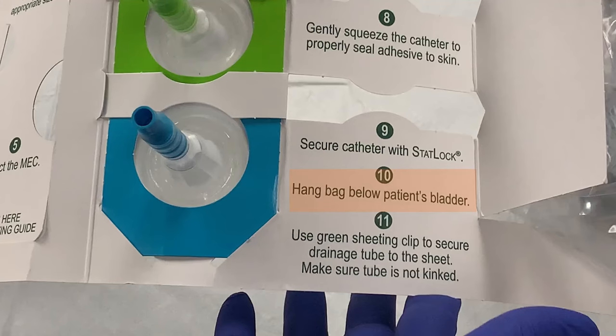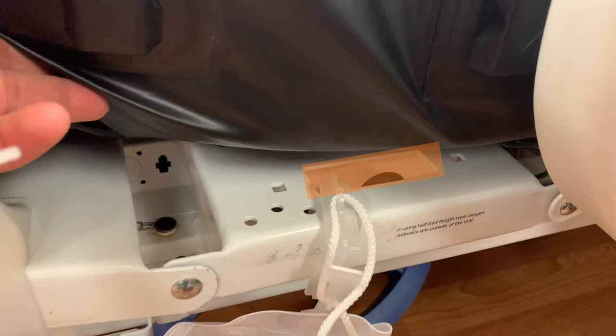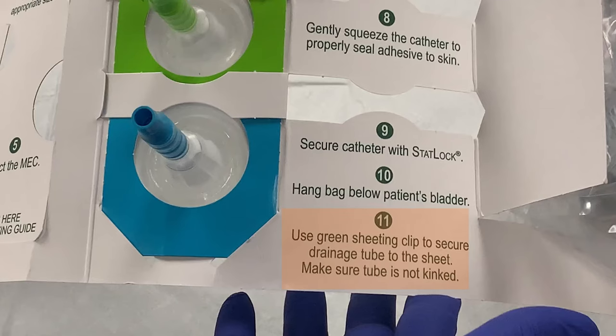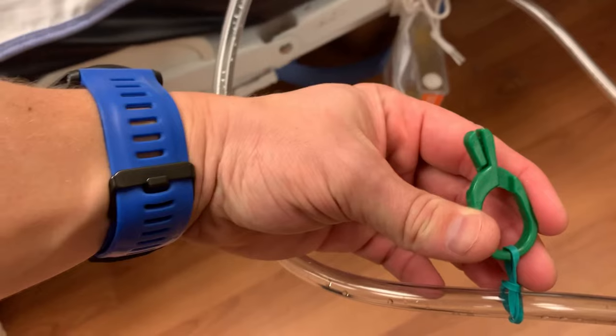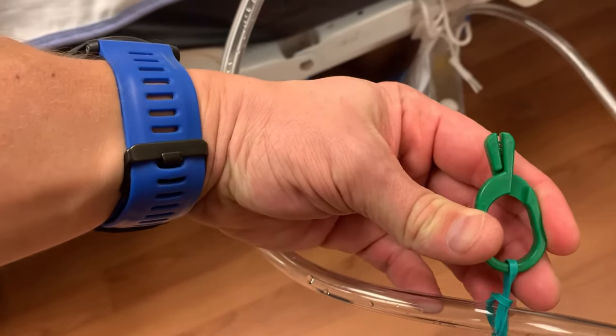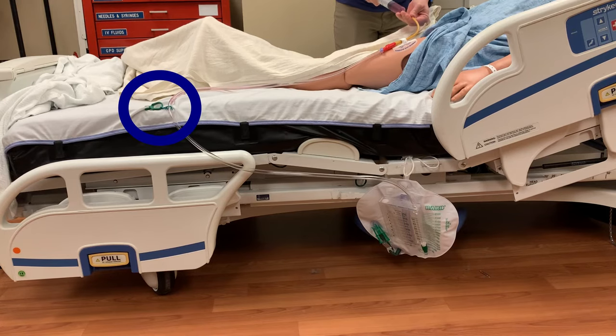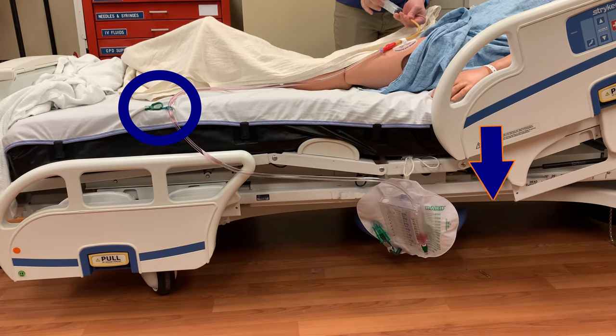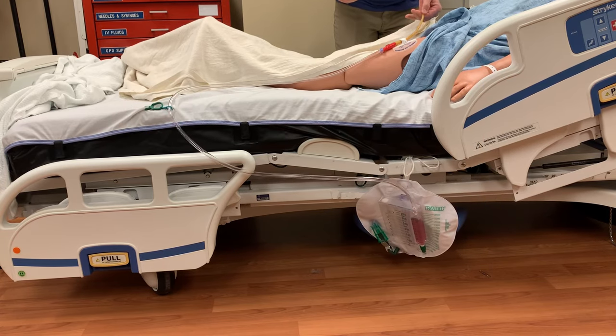Step ten is to hang the bag below the patient's bladder. Place the bag in the same location as is used for Foley catheter drainage bags — the rectangular cutout in the frame of the bed, which is also used for restraint placement. Step eleven is to use the green sheet clip to position the tubing to avoid dependent loops. Since gravity is the only force moving urine from the patient into the bag, the tubing should always provide a downward flow to the urine until it reaches the bag. For more information and strategies on avoiding dependent loops, you can watch the linked video.